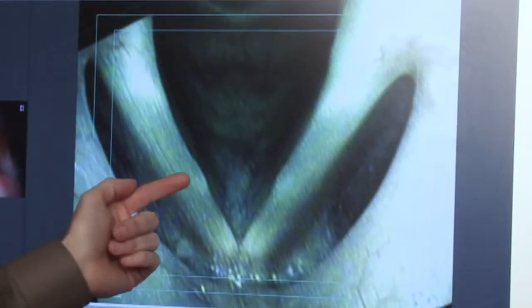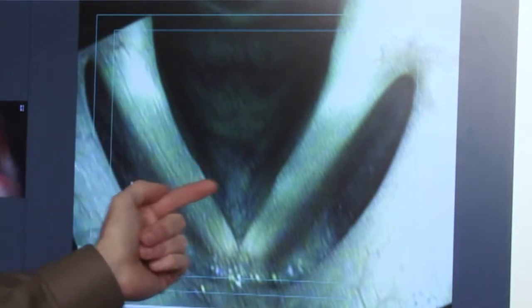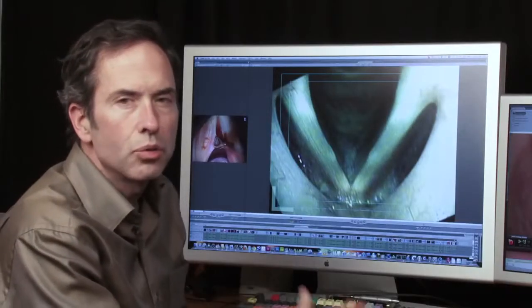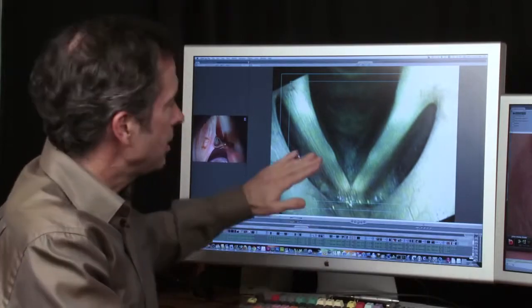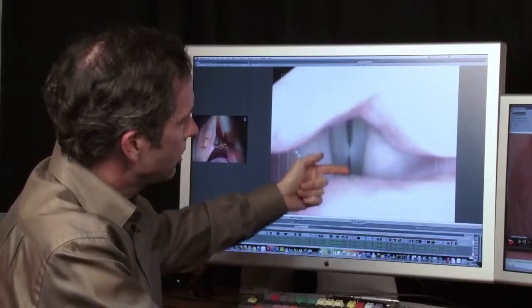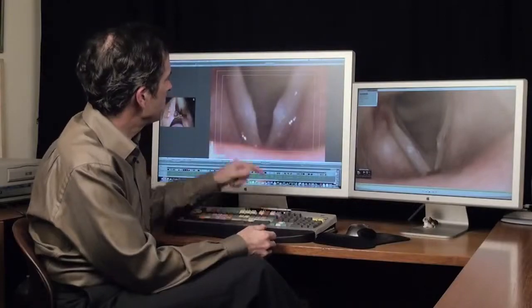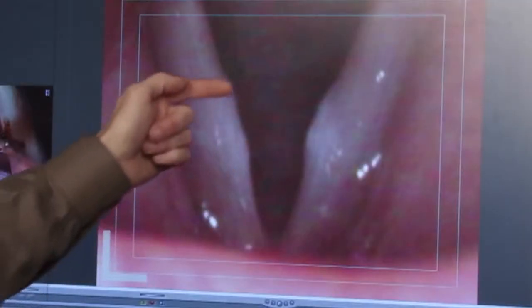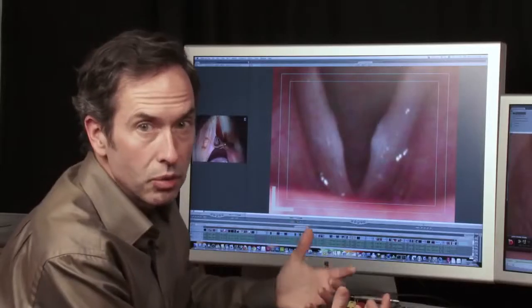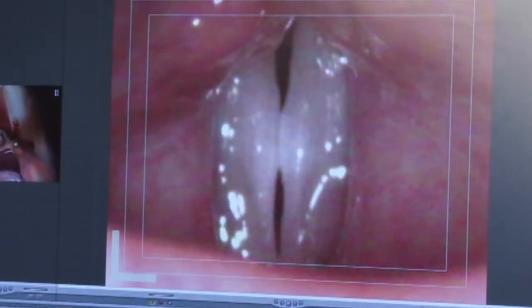This person overuses their voice. Halfway between the front and the back of the vocal cord is a little bump. That's a callus or a nodule of the vocal cord. They can be rather small, and even a small one, the bump stands out when you bring the vocal cords together and air leaks out from in front of and in back of the nodule. And here's another person who talks way too much and has very, very large vocal calluses, and when they come together, they have a big air leak.